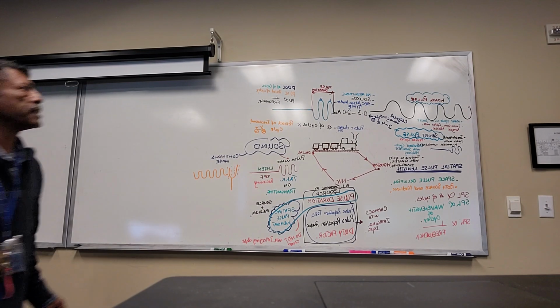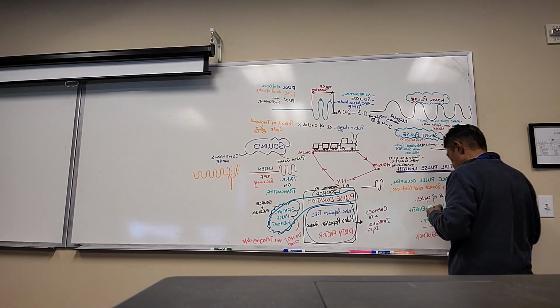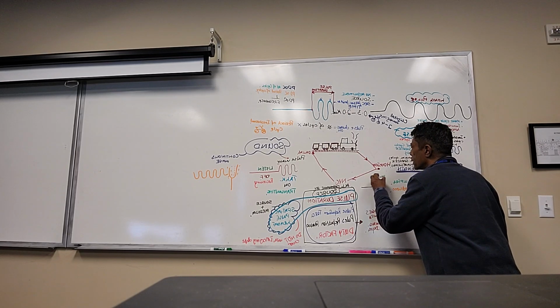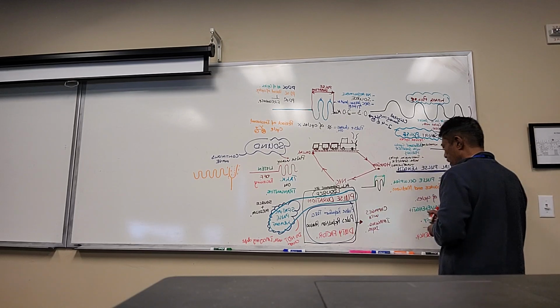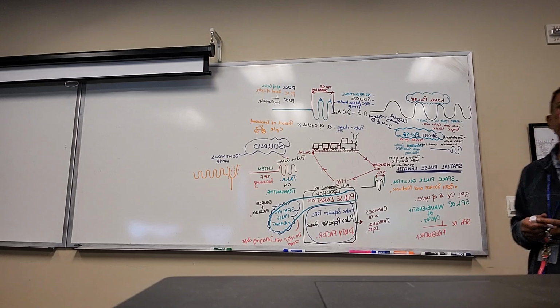Because this is what a spatial pulse length is. It is determined by the pulse, the transducer, right? You see this pulse? Then what is the spatial pulse length? From the beginning of the transmission to the end of transmission. This alone area is spatial pulse length. SPL. No, it's not adjustable.